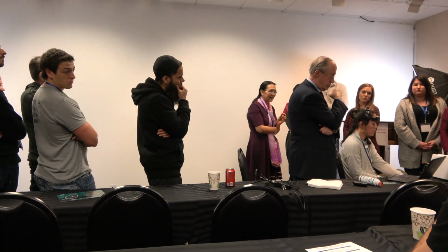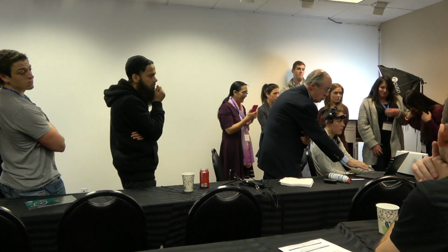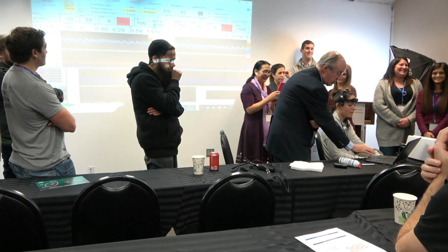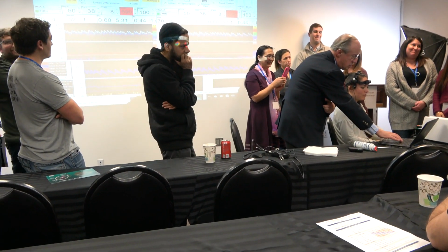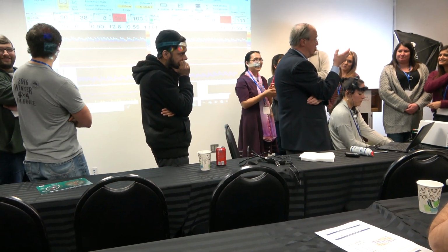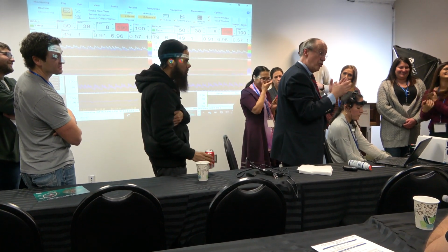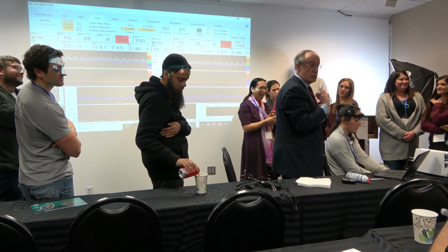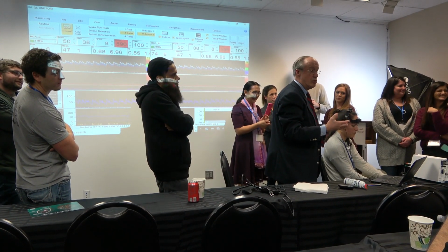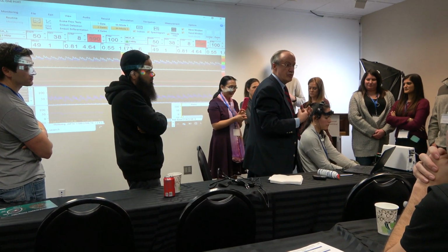We had couple trials run for migraine, but what established now is that how PFO was closed earlier, 10 years ago, it is open heart surgery. Now, researchers developed transcatheter closure device.